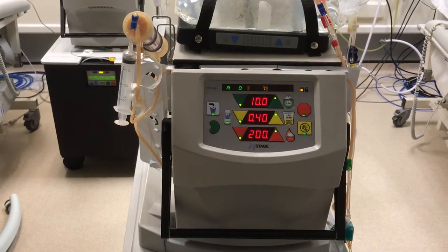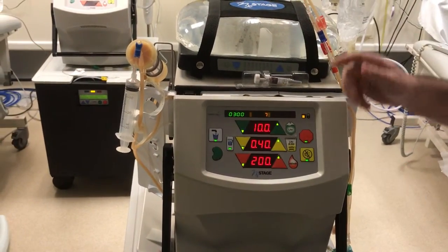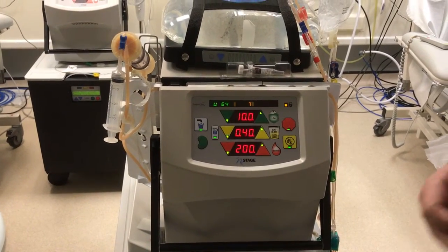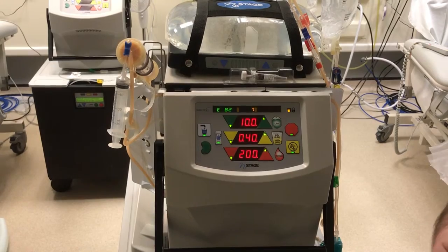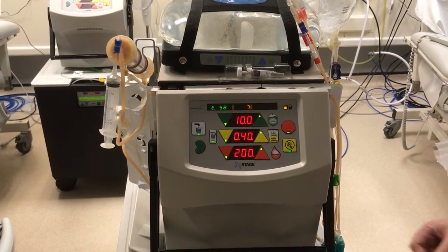Once it's done that, get a wipe. If you have your Heparin, your Clexane, your Epo, or your Iron, they need to all be given, but they need to be given separately. On the days they're required, this is what we need to do.